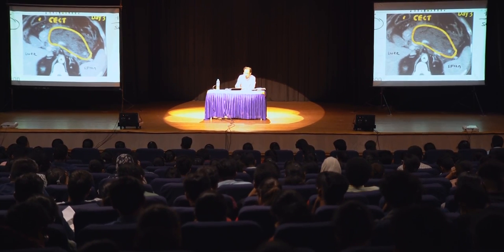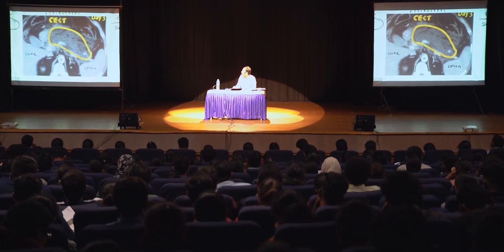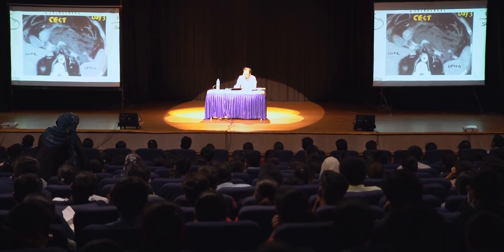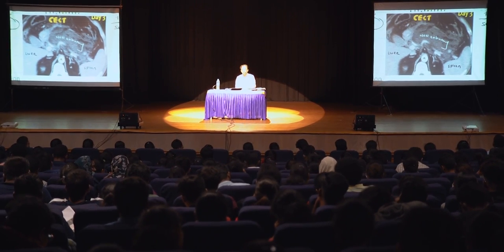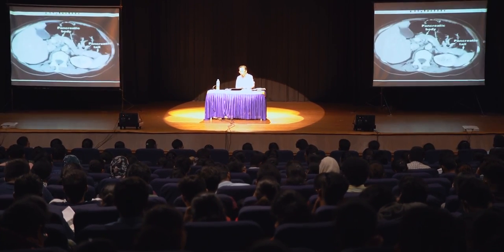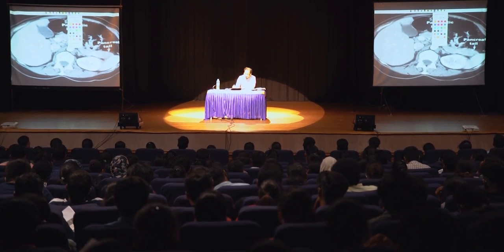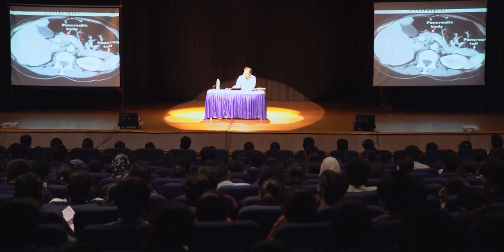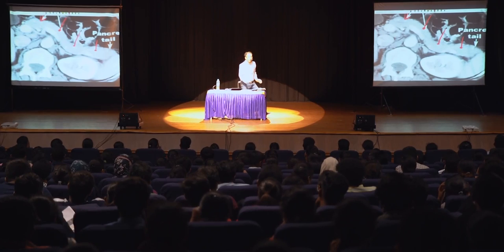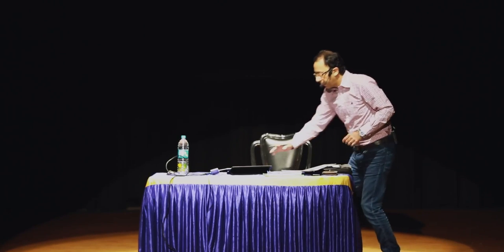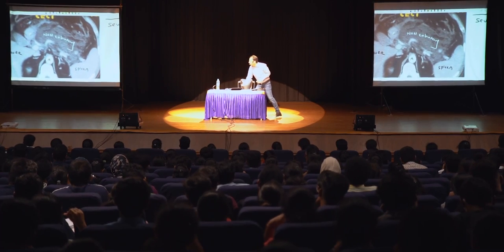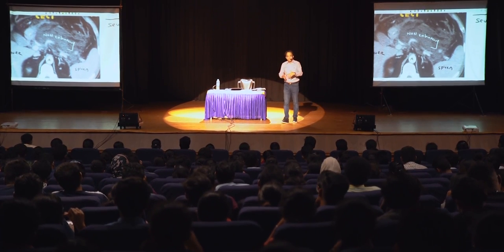Can any of you look at this image and tell me: this part of the pancreas — is it enhancing or non-enhancing? This is not taking up the dye. This is non-enhancing. There is no uptake of dye in this parenchyma. To help you, I will show you the normal again. A normal viable parenchyma should look like this. Now compare it: after 72 hours, when the edema has reduced, the parenchyma is still totally non-enhancing.